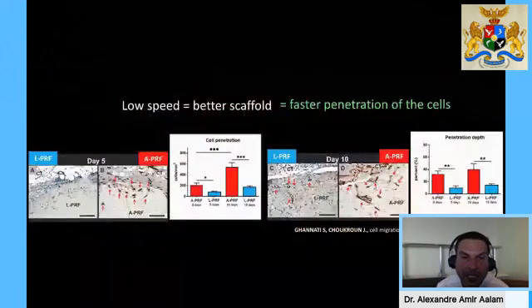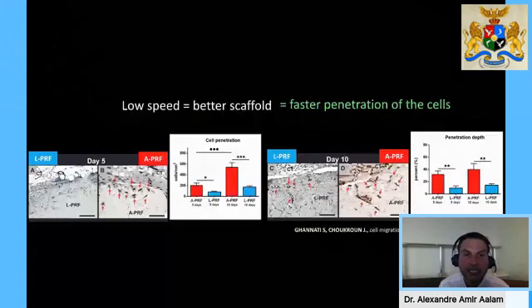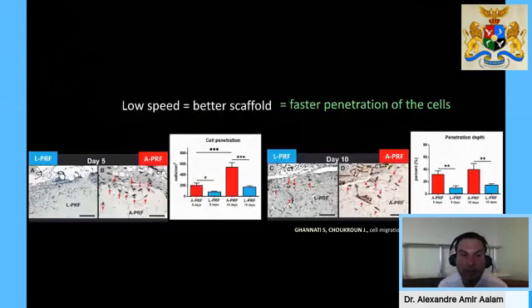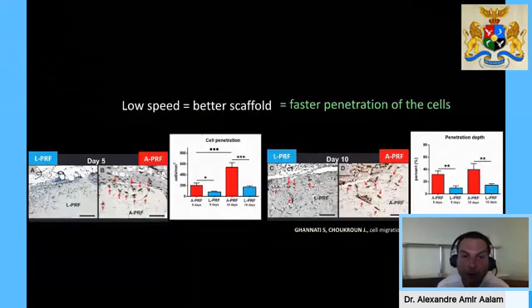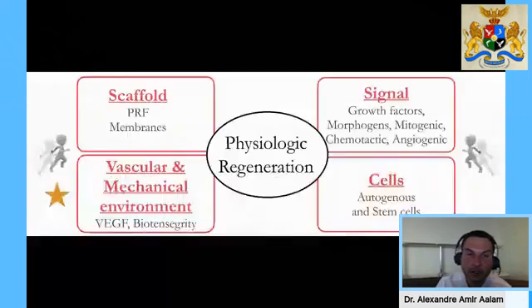One of the other advantages of using the APRF, and again, these are some studies that were done just recently, is that you can see those membranes are very porous. So correctly, they will most probably have less attractive physical attributes compared to your LPRF membranes that are much denser, much stronger, much bigger. But the cell penetration of the APRF is much greater due to its scaffolding properties. And I think this is where the mixture between the injectable and the membrane becomes a winning formula, by mixing those two technologies and being able to get the liquid form injected into the membranes, with slow release over the 2 weeks.